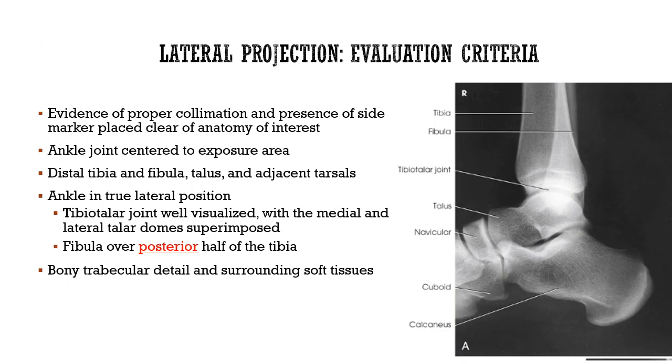So we're looking here at the ankle in the true lateral. We're going to have the fibula over the posterior half of the tibia.